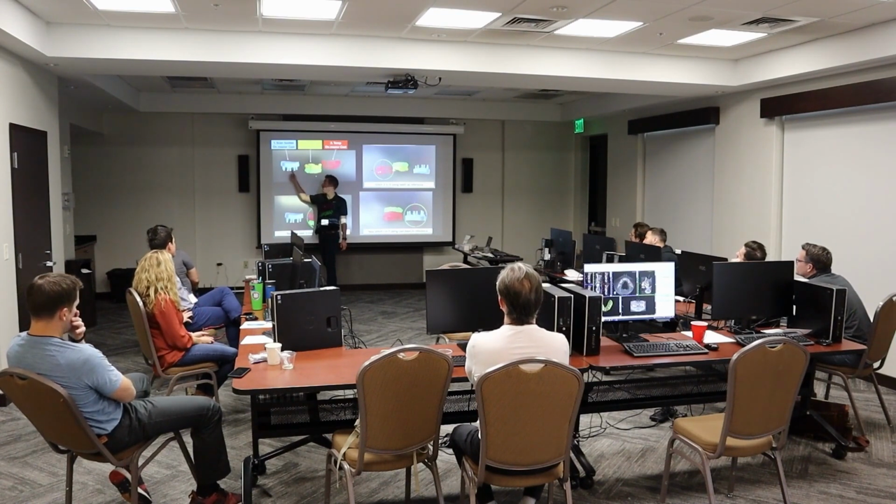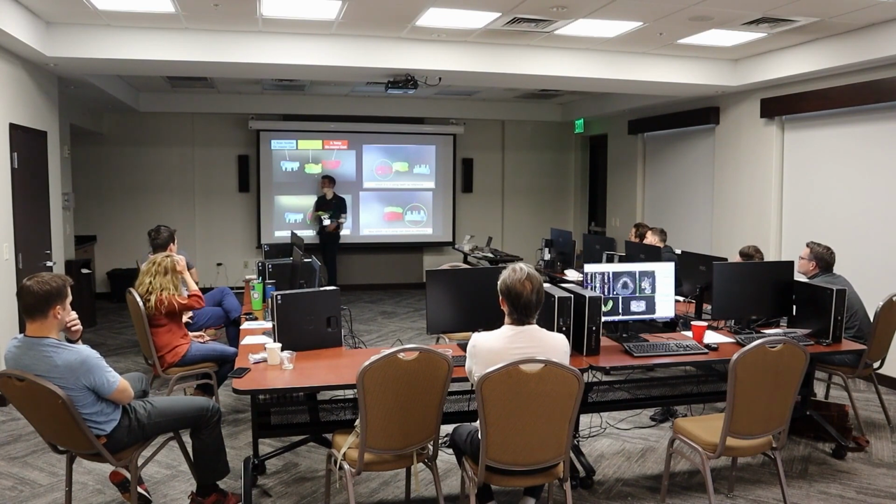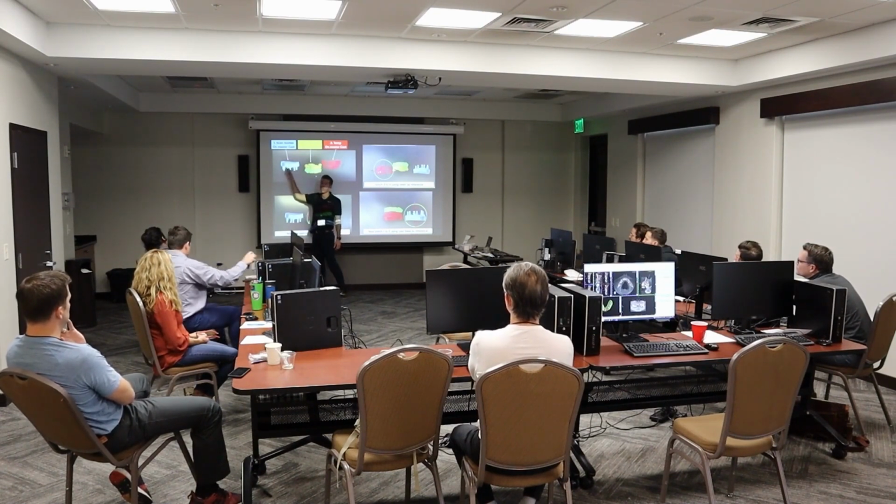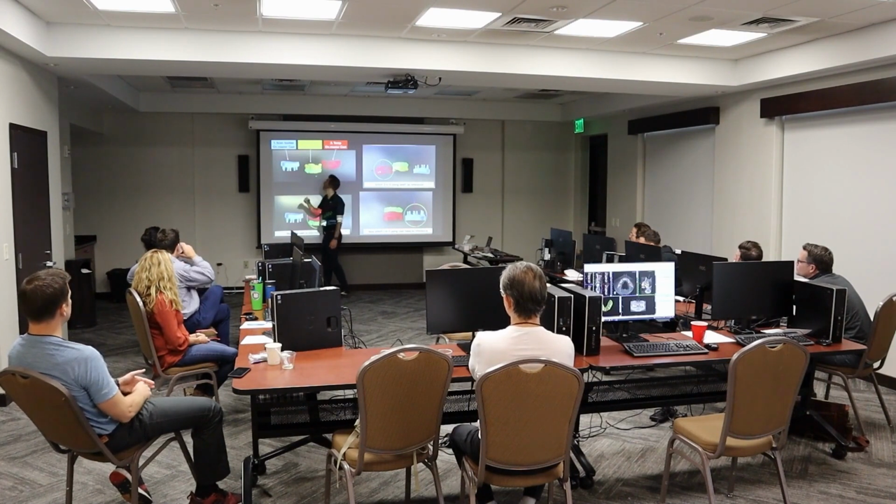And I do this part myself just because we've got a box scanner. We've got 6 lab scan bodies. I can throw them on the master cast, throw it in the box scanner, hit scan, and it creates this. But if you don't have a desktop scanner, your lab is going to do this once they receive the master cast. They're going to put scan bodies on and do the same thing. So just think about this scan number 1. This is the one that you can get or not get.